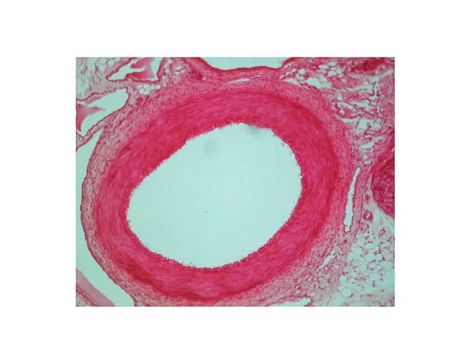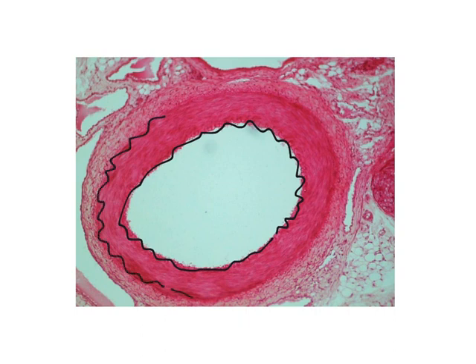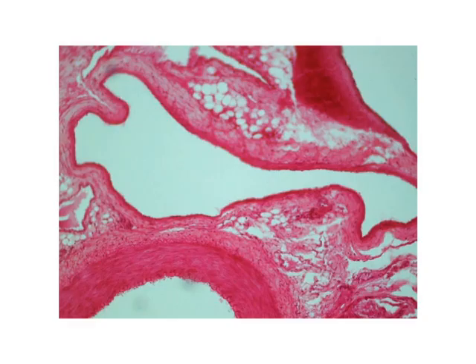I'm going to zoom in. So here is an artery. And what you're seeing, you kind of see where it does this. If you zoom in even more, you're going to see it do this. There you're seeing an internal elastic membrane. Out here, you'll see it again do something like that. That's actually the external elastic membrane. Here's all that smooth muscle that you're seeing. And out here is the tunica externa. Also, just to bring your attention, if you look carefully, what do you think that is? You should be able to identify that connective tissue real easily. So I'm just going to see if you remember it. I'm not going to give you the answer.